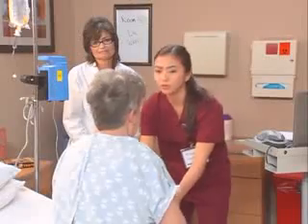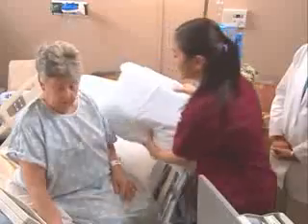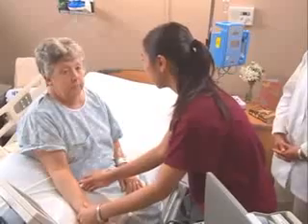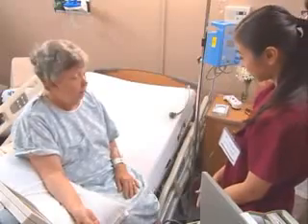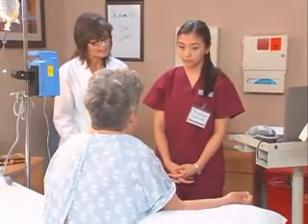Okay, put your arm over like this, and I'll put your arm on a pillow to make sure your forearm is supported. That way it's at level with her heart. How's that feel? Fine, I guess. Okay, do you still have any dizziness, lightheadedness? No, I'm okay so far. Okay, so we wait a few minutes.